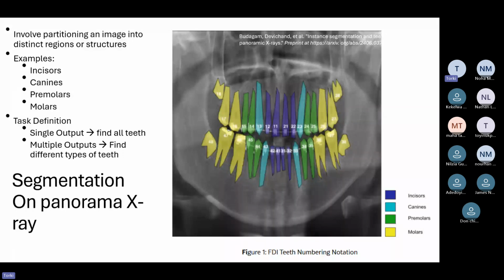I'm not sure if I have the pointer option. Maybe let's begin with the other metrics, like the intersection over union and the Dice index, which show how well the prediction matches reality. I will give you an example. For this tooth, I produced this mask.